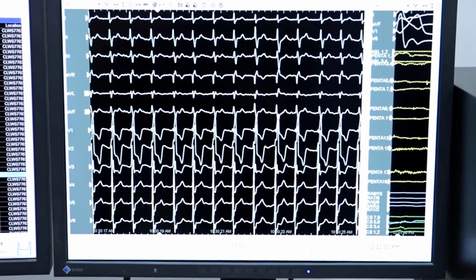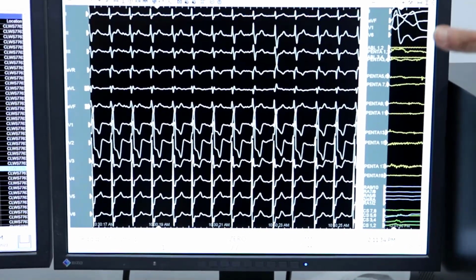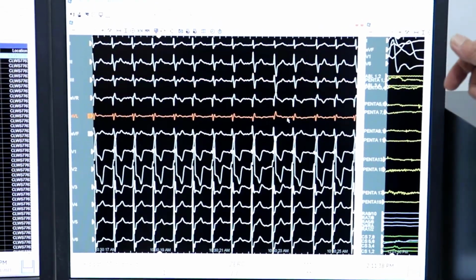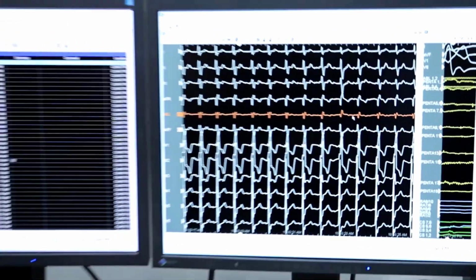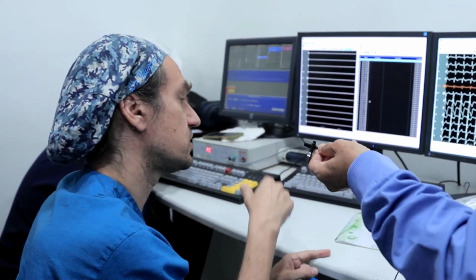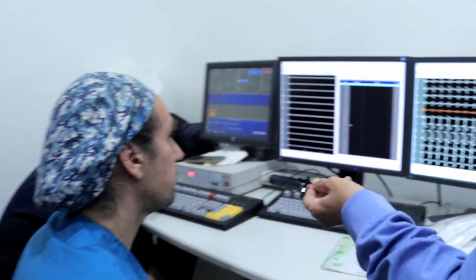So this is the other one. Was there a focal atrial tachycardia near? No, this is re-entrant. Apparently, we believe that both of them are the same, just one rotated on one side, the other rotated on the other side. Both are CTI-dependent.